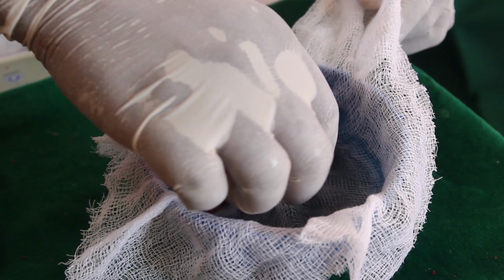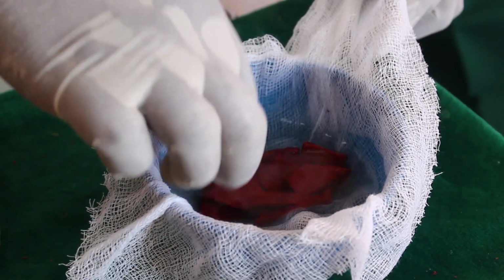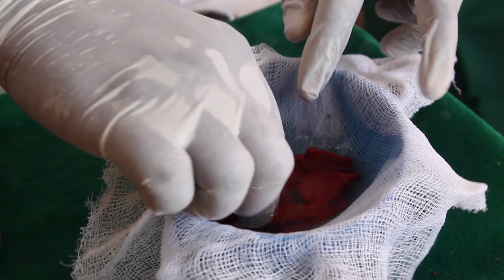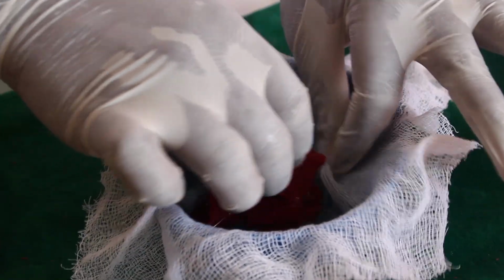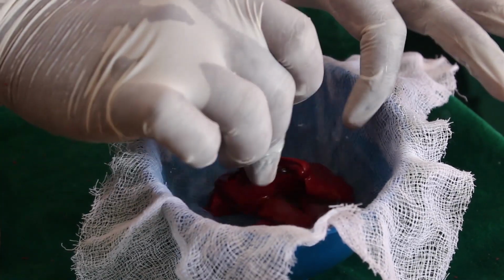So the softening temperature is a minimum of 132 degrees Fahrenheit. So allow the material to be softened in hot water. And here the advantage of hot water is it acts as a plasticizer. It will help the material to flow properly. So make sure that while kneading this impression material, the material has to be in the water, not outside the water.